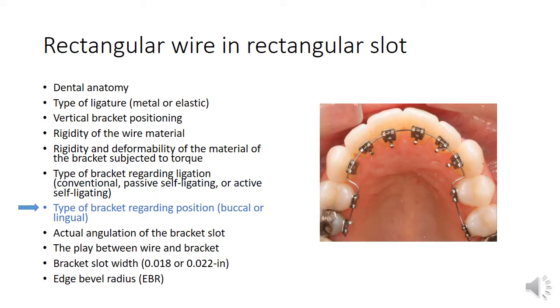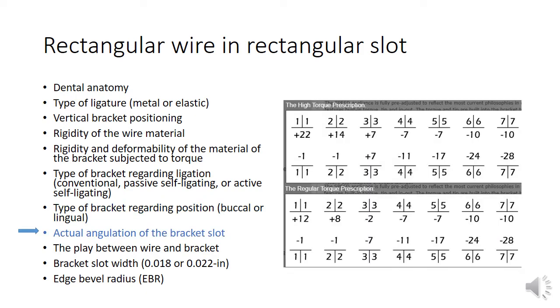Studies show that lingual brackets are more efficient in expressing the torque of brackets, although there are some variations in different brands of lingual brackets. There are quite a variety of different prescriptions of brackets in the market. For example, Speed self-ligating brackets come in 4 different prescriptions: high, medium, regular, and Hansen prescription.